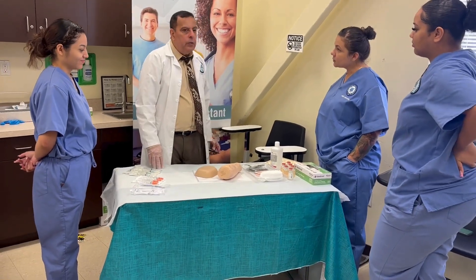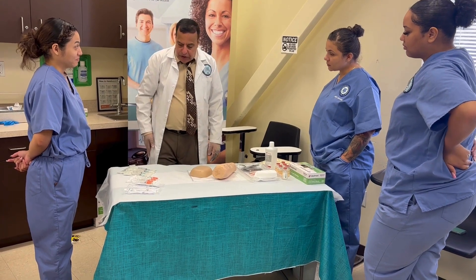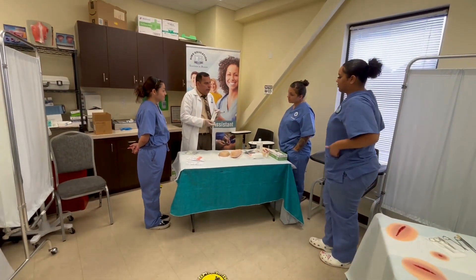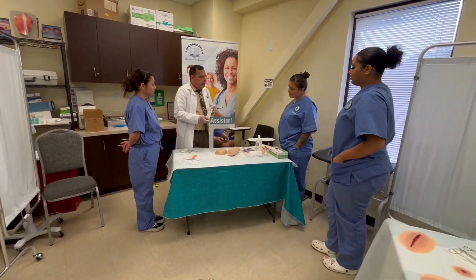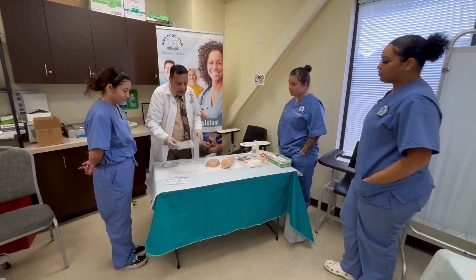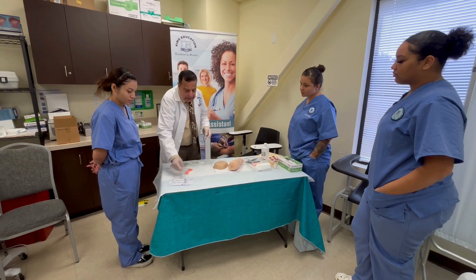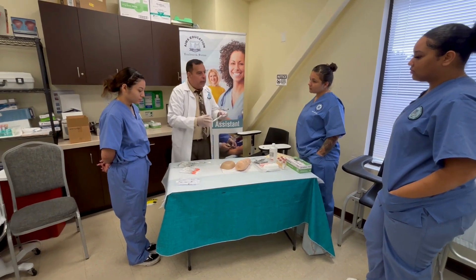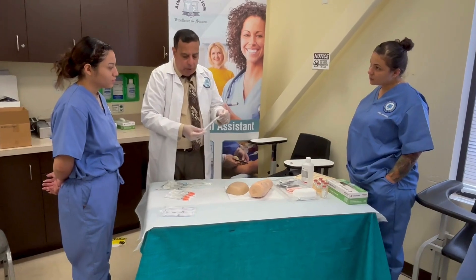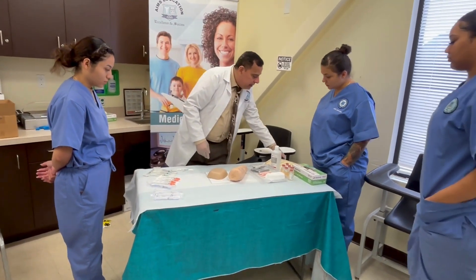Today we're going to learn how to give a patient an injection. We have three types of injection: the hypodermic needle used to give injection into the muscle, the subcutaneous needle for insulin, and the tuberculin needle for the intradermal skin test and the tuberculin test.